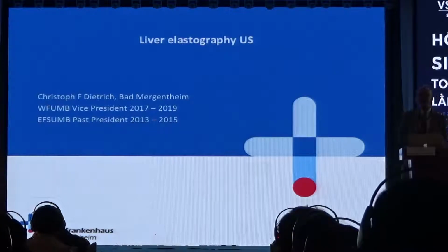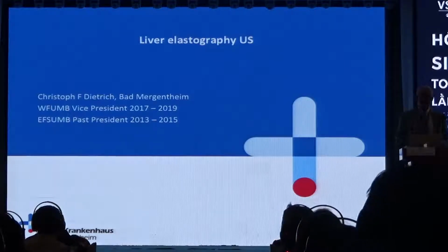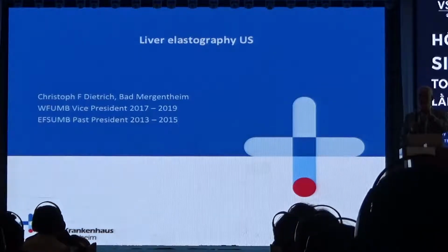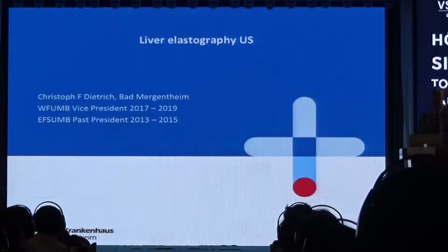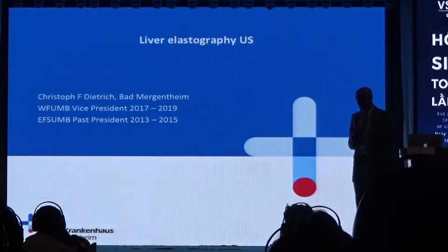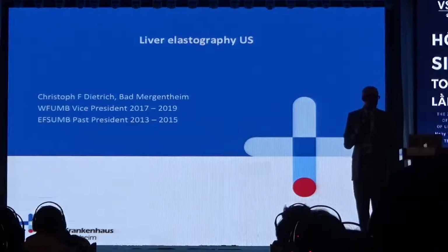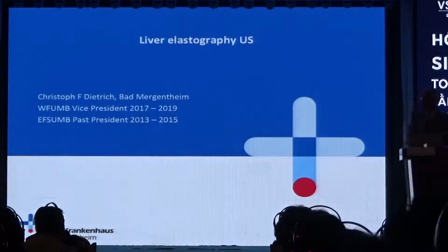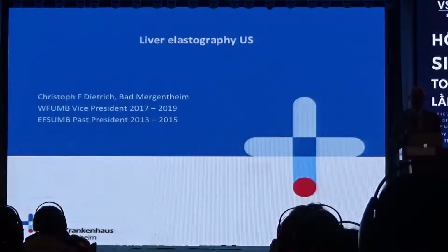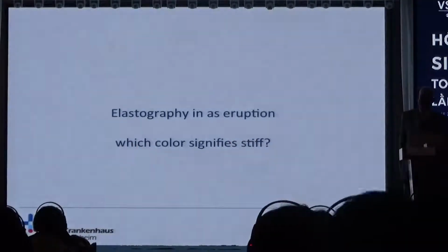Now we have already focused on the liver, and honestly, the liver, if you look through all applications, has a clear-cut evidence, a yes-no response. If we have low values, it will influence our treatment. It is of clinical importance. In other imaging methods, we have to find out. I wonder about your presentation, how clearly we can answer questions in the breast, in the prostate, in the testis, and in other organs.